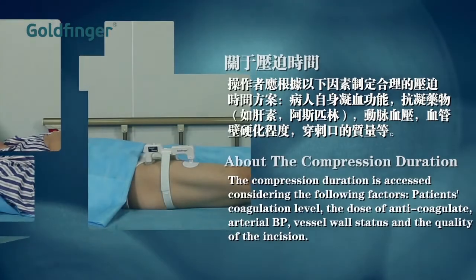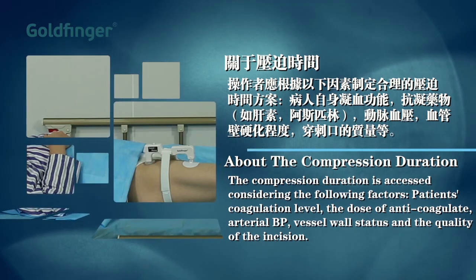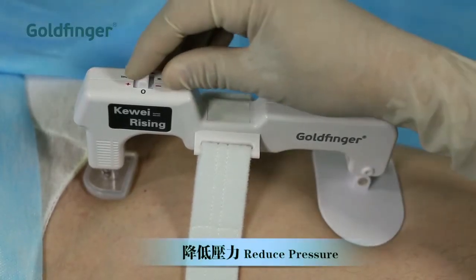The compression duration is assessed considering the following factors: patient's coagulation level, the dose and type of anticoagulant, arterial blood pressure, vessel wall status, and the quality of the incision. Reduce the pressure when the hemostasis compression is finished.